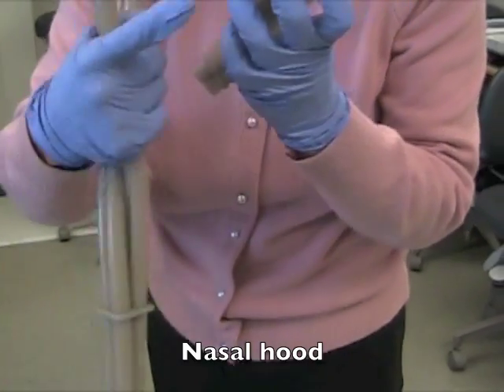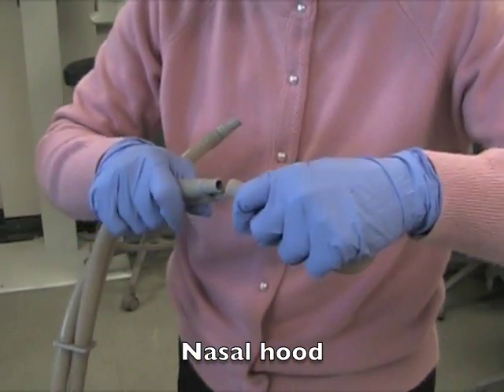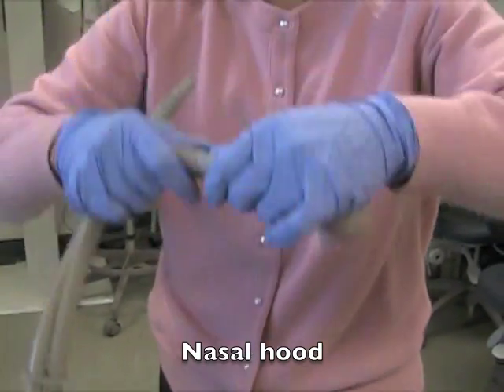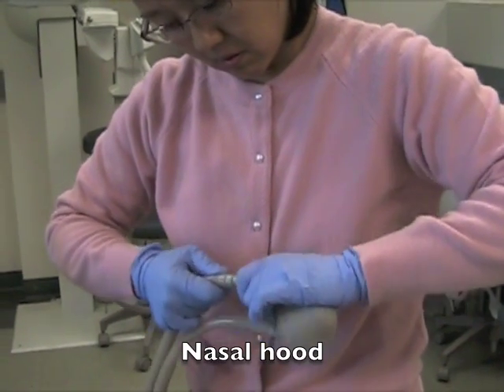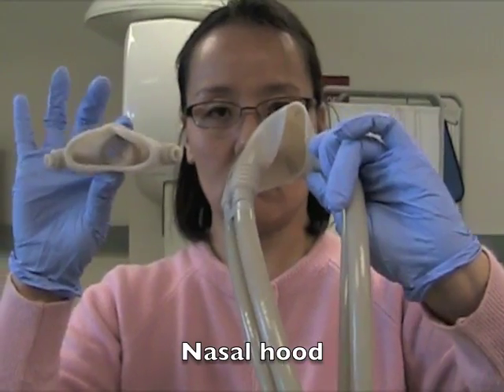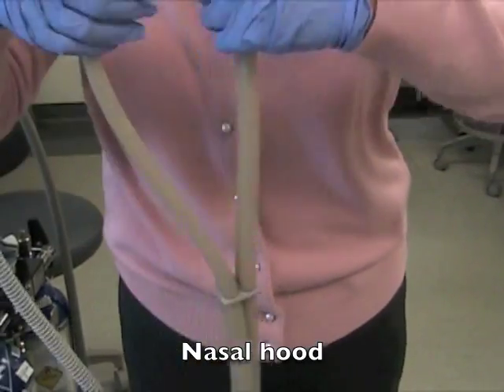This is how to connect the nasal hood to the hoses. The bigger hole goes to the bigger tube; the smaller hole goes to the smaller tube. The nasal hood is two layers — the inner mask must be placed correctly.